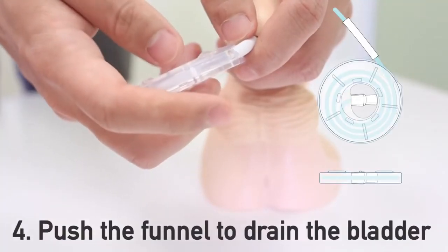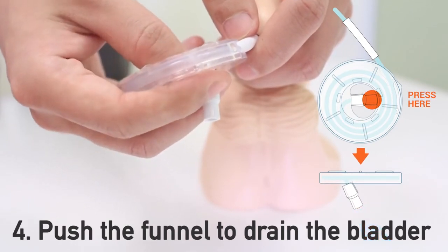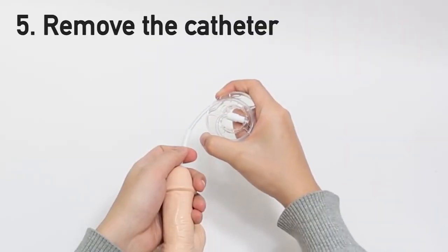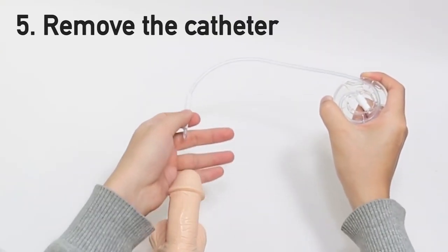When you're ready to drain, aim the catheter in the desired location and unplug the funnel by pushing it outward. Once the bladder is empty and you're done draining, slowly remove the catheter from the urethra.